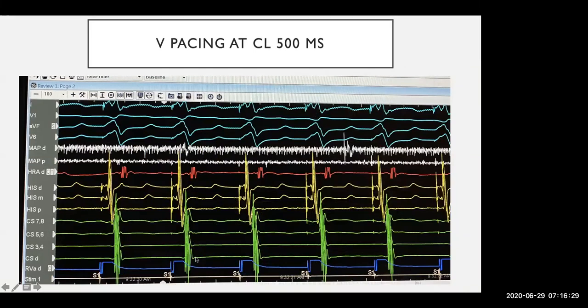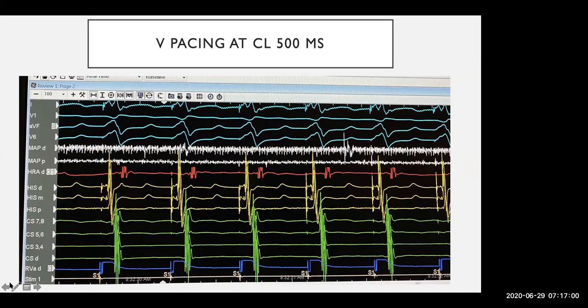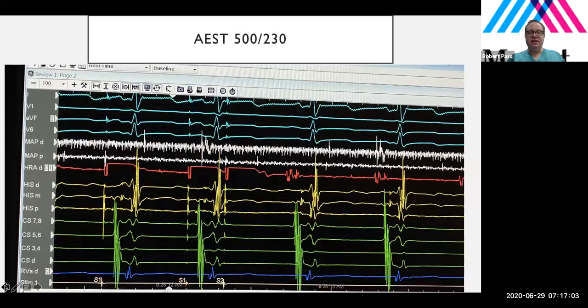It does, yeah. So what we're seeing here appears to be conduction of the AV node, right? Because the A is probably smushed into the V here. And all of these electrograms are either on time with one another, or certainly it doesn't have the pattern where it's clear. I think you would agree that CS distal is not obviously earlier than CS proximal or than the His. Do you agree with that? That's for sure. And that's quite different, say, than here.